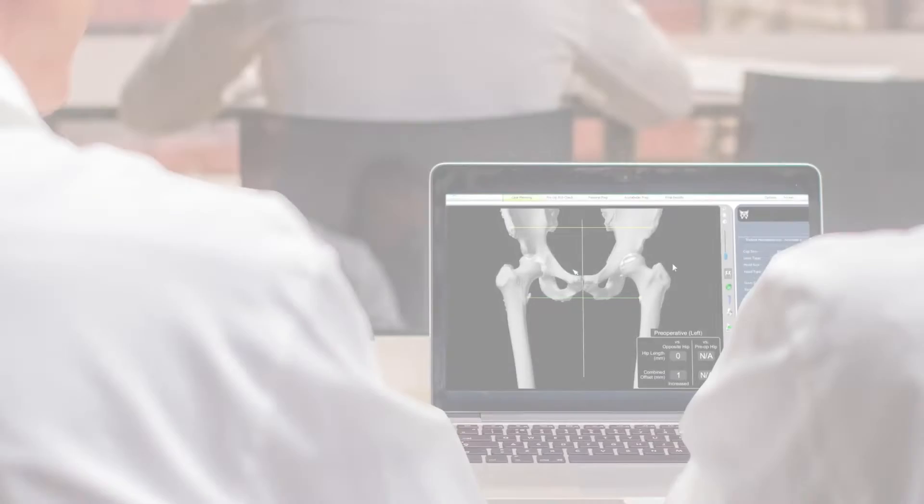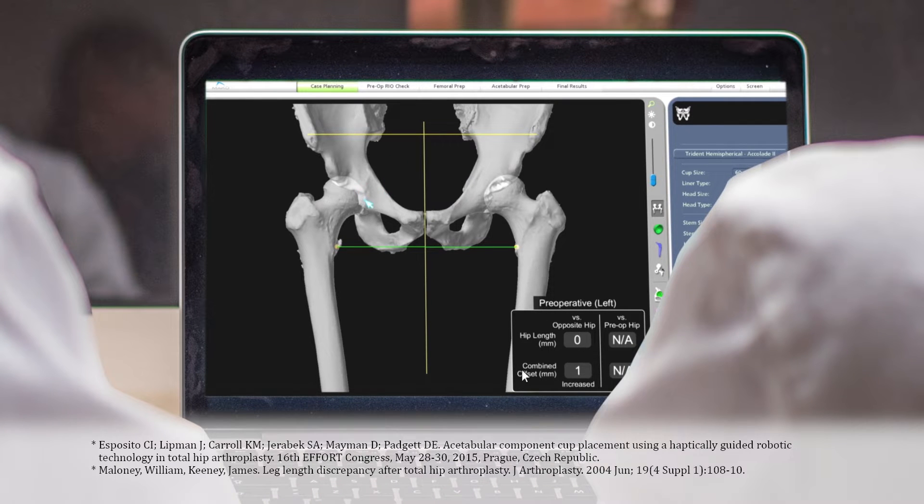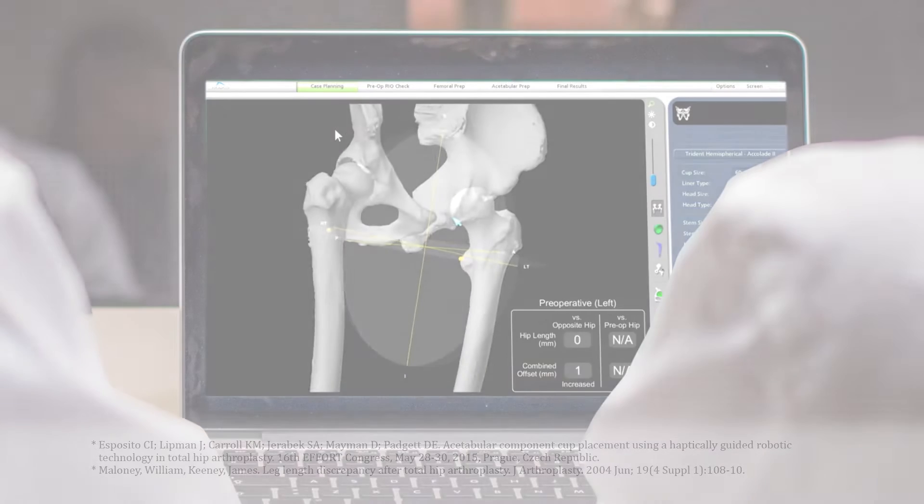Prior to surgery, the surgeon reviews the plan size and placement of the implant. If necessary, the surgeon modifies the preoperative plan to help control important measures of hip stability.